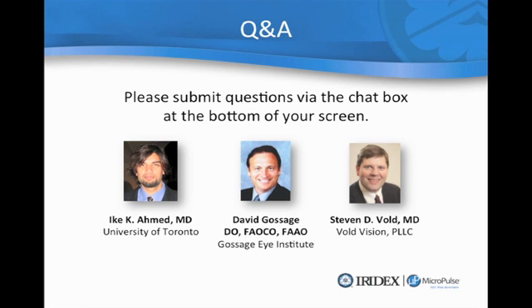Well, I'll take a stab at this here first. Following filtration surgery, and I think this is with any laser trabeculoplasty procedure, the efficacy is going to be less. You have to be a little bit more careful about pressure spikes, although I have not seen that with MLT. In pseudophakic patients, to be frankly honest with you, if they've just had straight cataract surgery, to me those are very similar to those of just a virgin eye, and so I feel very comfortable doing that. Anytime you've had filtration surgery and have more advanced disease, my experience has been that the results are not always as good.